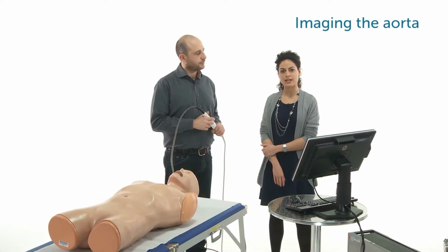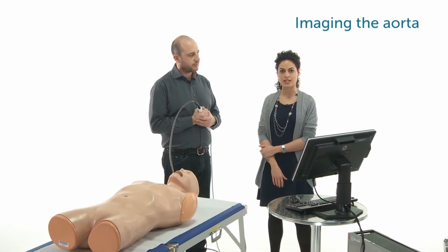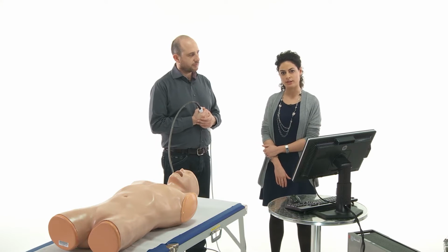So far, we've only dealt with the heart itself. Now it's time to look at the great vessels, and specifically the aorta. When we are in our echo lab and we perform a transesophageal exam, we always look at the aorta. When we finish the exam, by retrieving the probe, we can really scan the vessel.